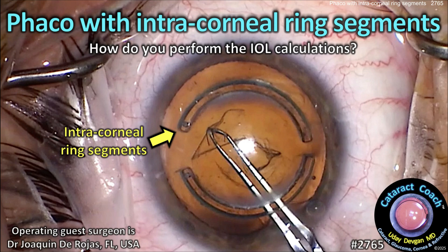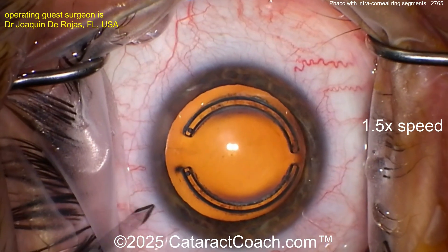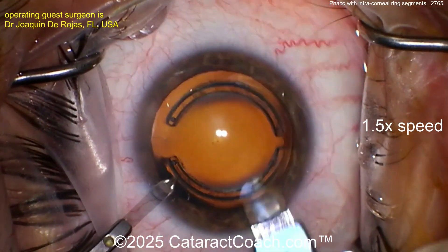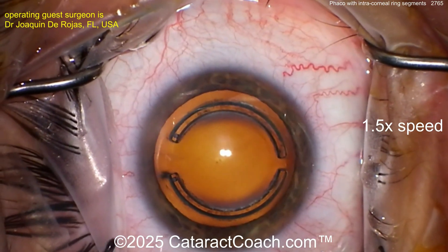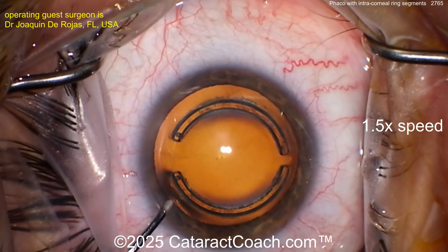Cataractcoach.com — phaco with intracorneal ring segments. In this case, how do you perform the lens calculations and why are these ring segments in the cornea? You can see two diamond blades being used — one side port, one keratome — to make the two incisions at the same time. Our guest surgeon is Dr. Joaquin de Rojas.